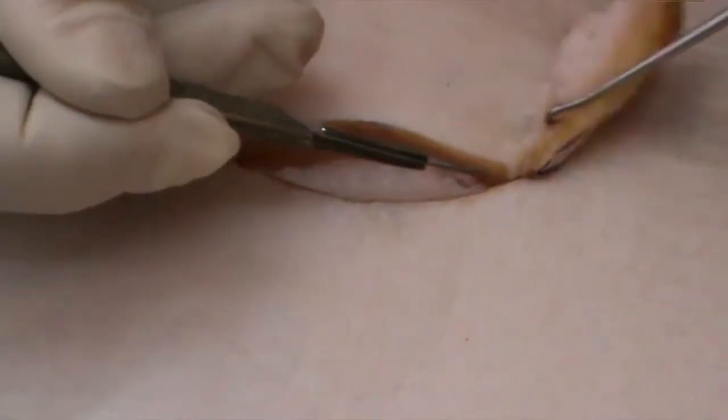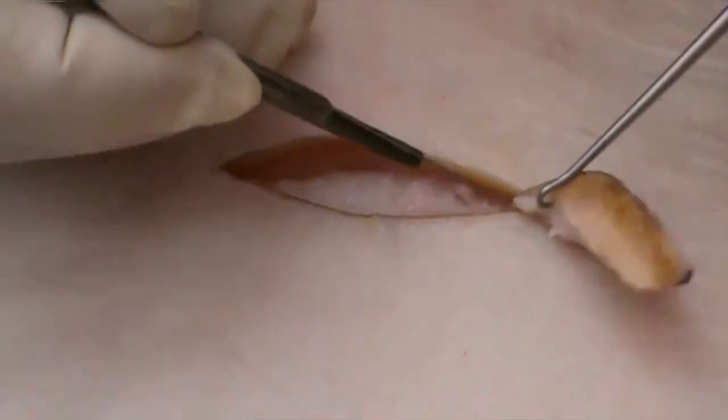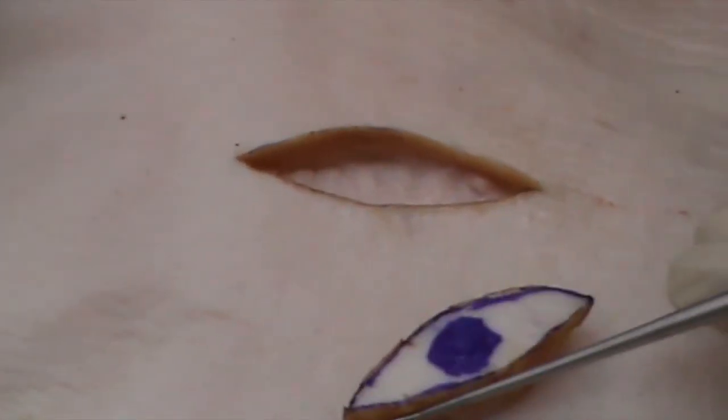This is where a skin hook can be so useful. Then to remove your specimen — and that's going to go off for histology.